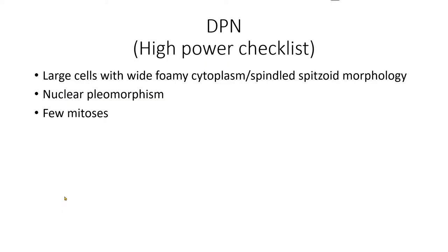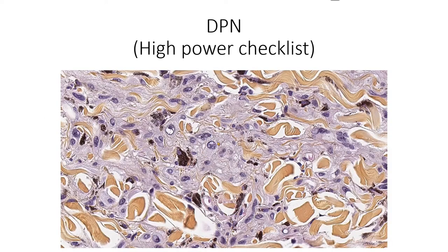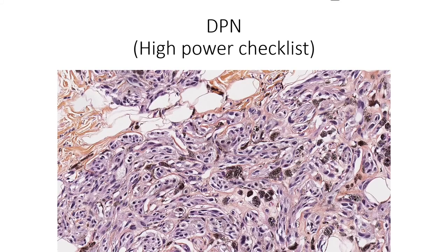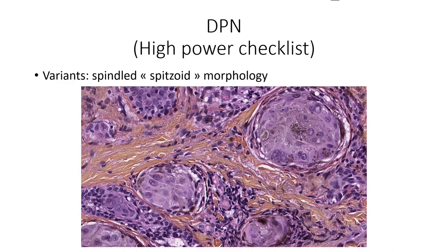On high power, you will look at the cytology. The DPN can be made either of large cells with a wide foamy cytoplasm or spindle spitzoid morphology. There are different types of morphology. There is some degree of nuclear pleomorphism and only a few mitotic figures. Here's a typical aspect of the foamy type of melanocytes. Here again, more spindled but still with a foamy cytoplasm. Here is a more spindle spitz-like morphology.